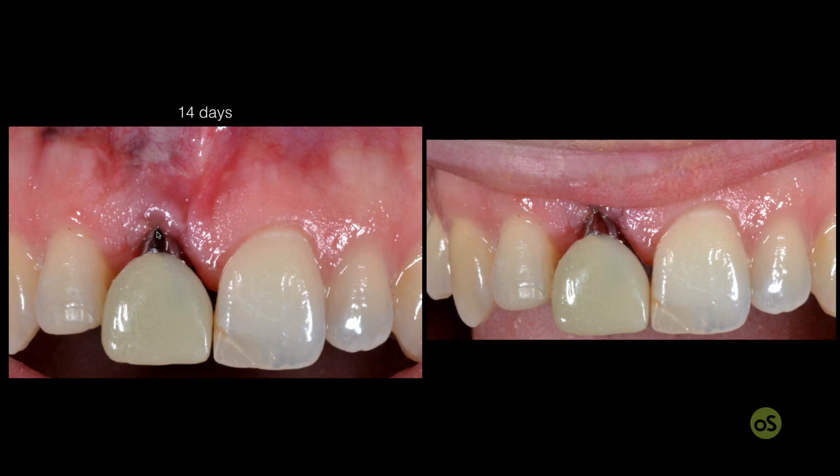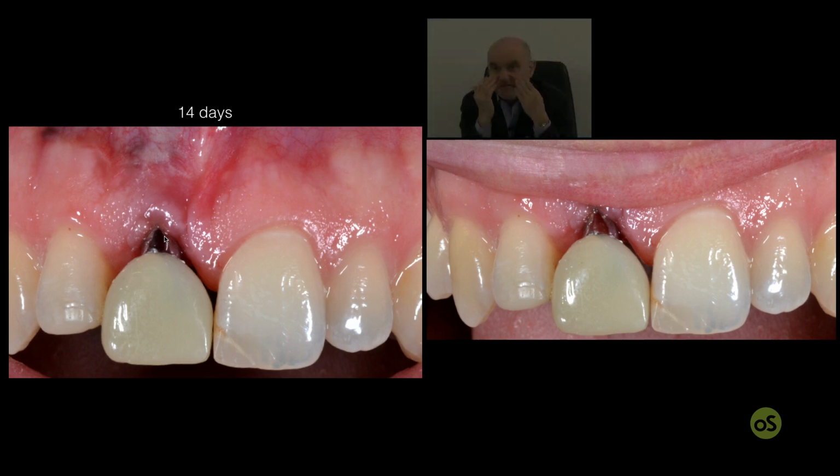If there is a patient that really doesn't want to accept this, the only way is to place an abutment and to mask this abutment underneath a Maryland solution that is done only for aesthetic reasons. But this is something I don't like, because if there is a Maryland above the abutment, the capability of the patient to keep clean, but also to brush in the correct way in order to improve the soft tissue, is much less, or let's say very, very much less.